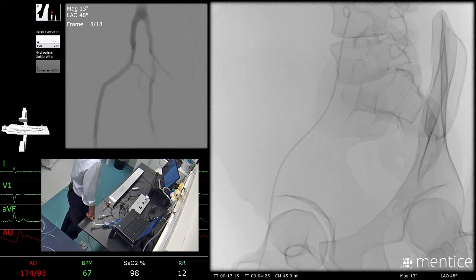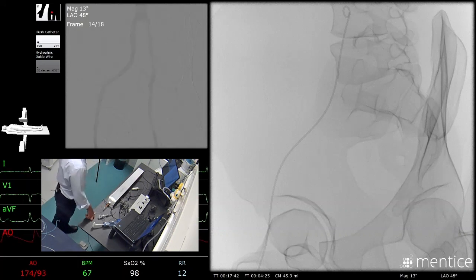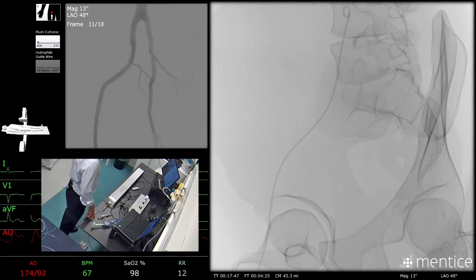If you're doing pressure measurements, most operators, I think, if it does come to that situation, will also give a vasodilator such as nitroglycerin, which is the equivalent of an exercise test, and will exacerbate any significant gradient that may involve a so-called significant stenosis. But with vasodilators, you'd expect the gradient to go up to at least 20 or even 30 millimeters mercury before we consider it significant. In my practice, we very rarely use pressures nowadays.